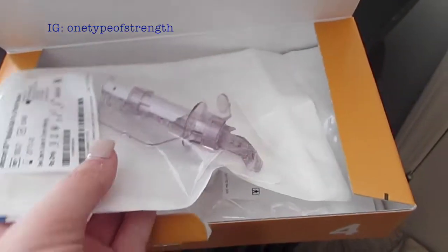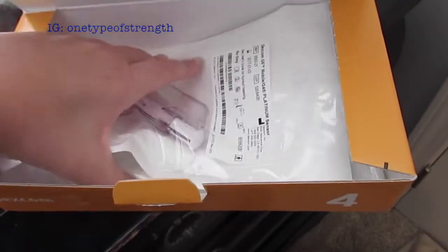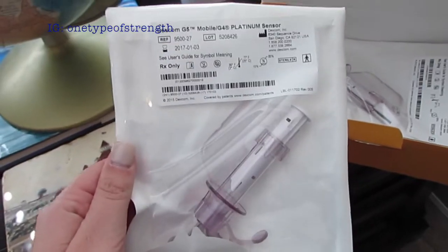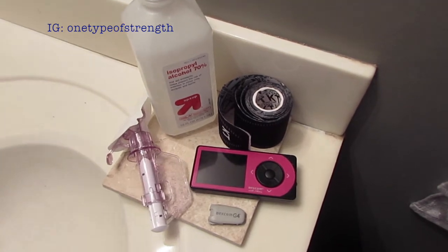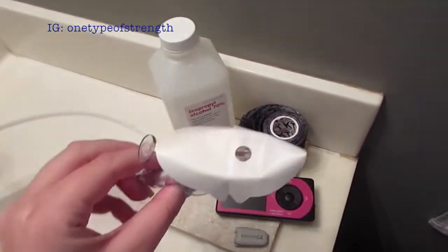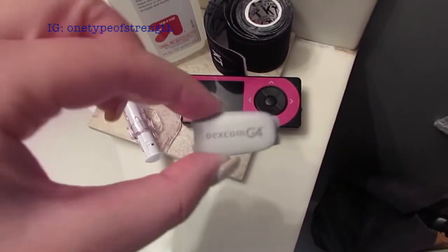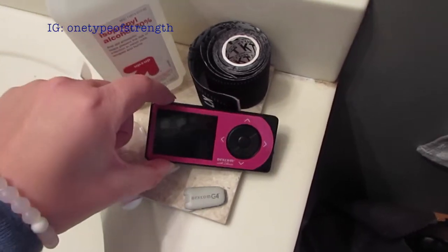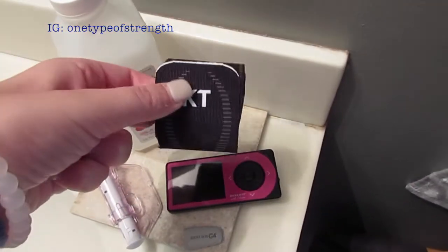This is what the Dexcom sensors look like — they come in a pack of four. This is the one I will be using today for my upper thigh site. Here is what I need for a site change: rubbing alcohol, a new sensor, my G4 transmitter piece, my Dexcom G4 receiver with Share, and some KT tape.